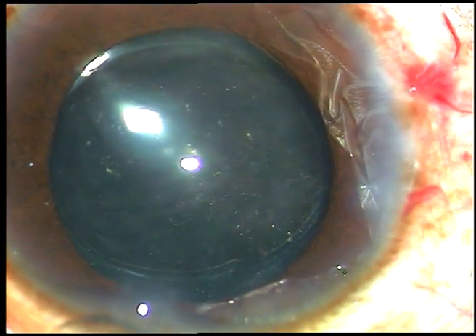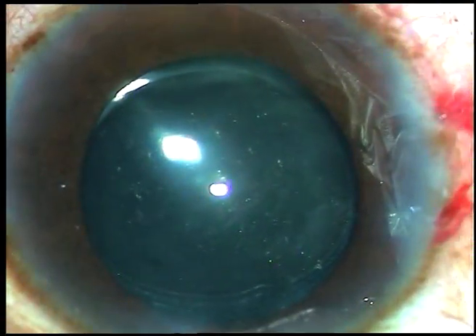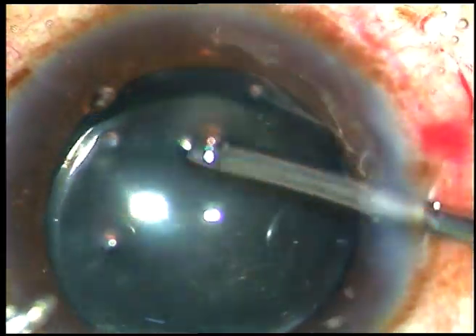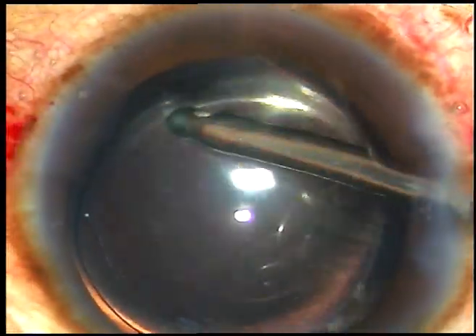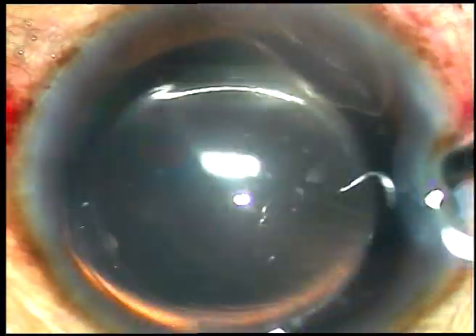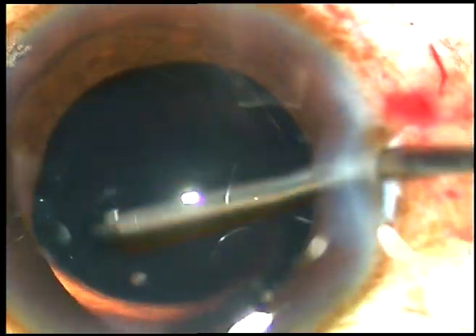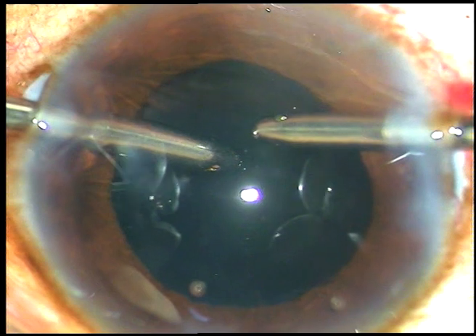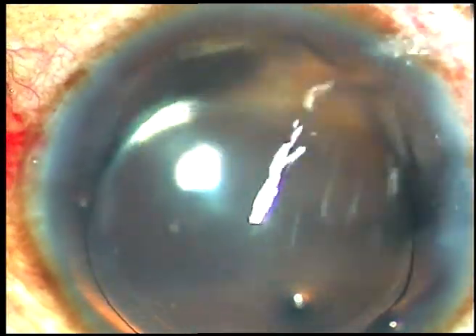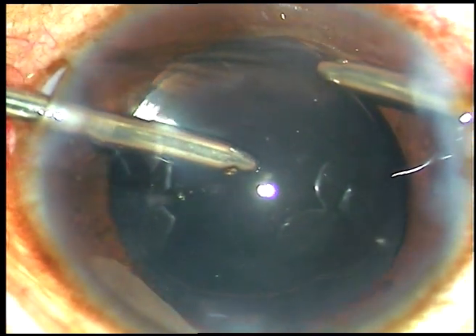A lot of visco has been removed by the Simcoe itself. Now I am going to use the irrigating probe. At this time you will be able to see LIDRS — Lens Iris Diaphragm Retropulsion Syndrome. See here, the pupil is becoming large and small. When irrigation-aspiration is done it is small; when it is not done, it is enlarged. This is LIDRS — Lens Iris Diaphragm Retropulsion Syndrome.